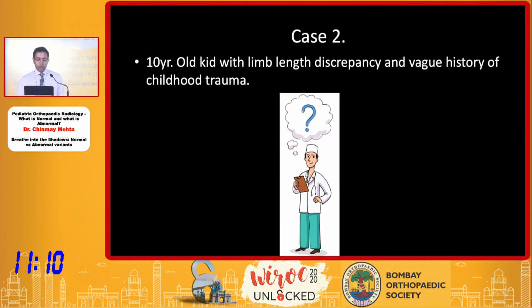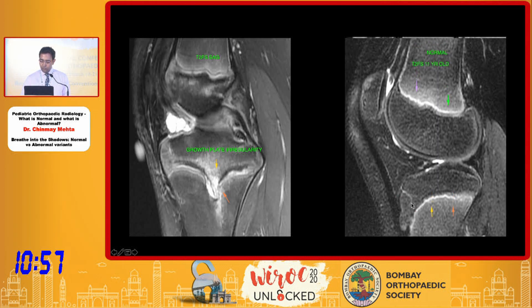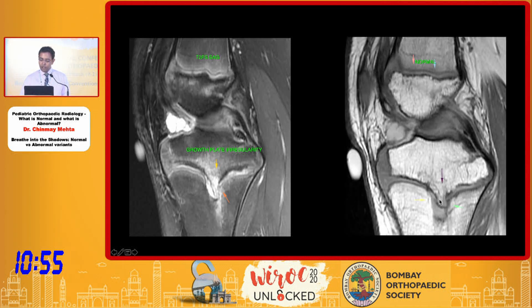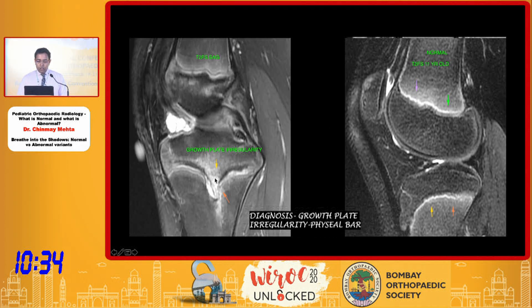Let's look at the second case: a 10-year-old kid with limb length discrepancy and a vague history of childhood trauma. When you look at this physis on a fluid-sensitive sequence, there is an abrupt interruption of the growth plate with a discrete physeal bar closing it. That's the typical physeal bar we see whenever there has been an old history of trauma or infection. The normal physis should have been contiguous.